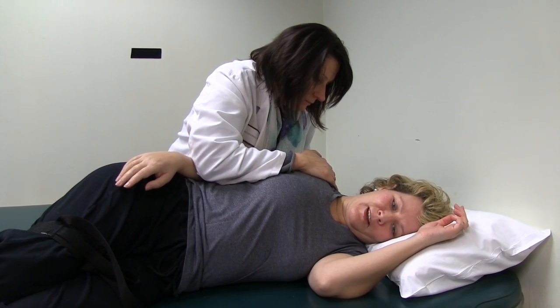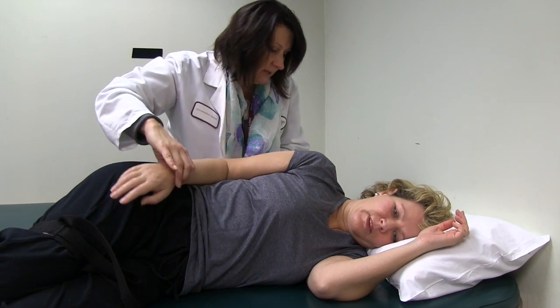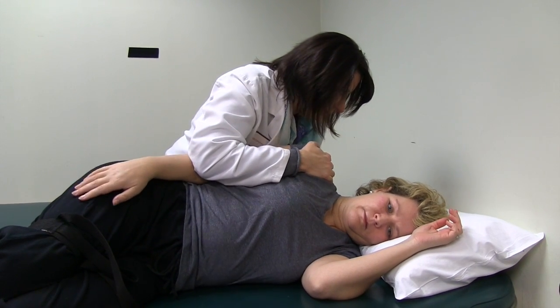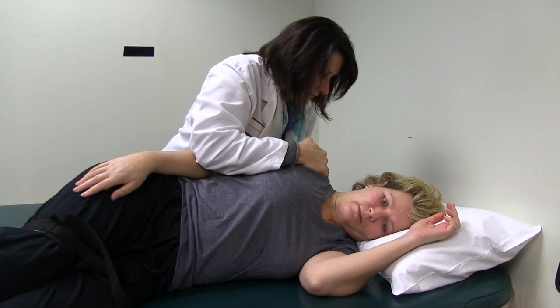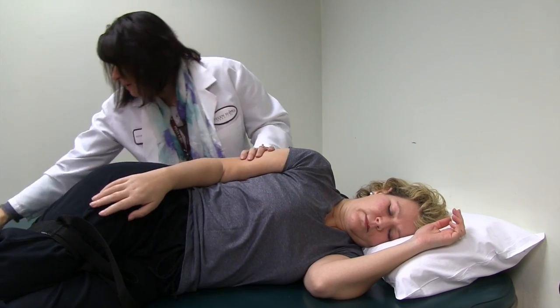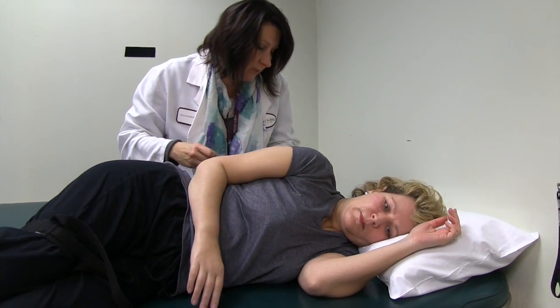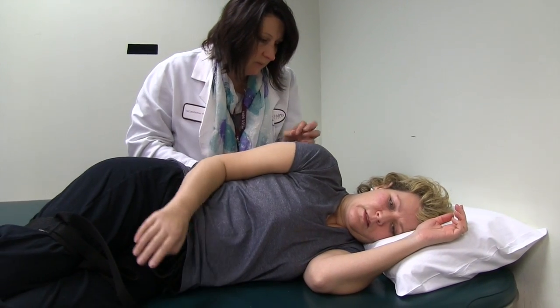I used my elbow — more of my elbow, yes. I want really more of these guys here. Try pulling back again. I'm going to put the electrodes on your muscles in between your shoulder blades back here to try and get that muscle to fire more.